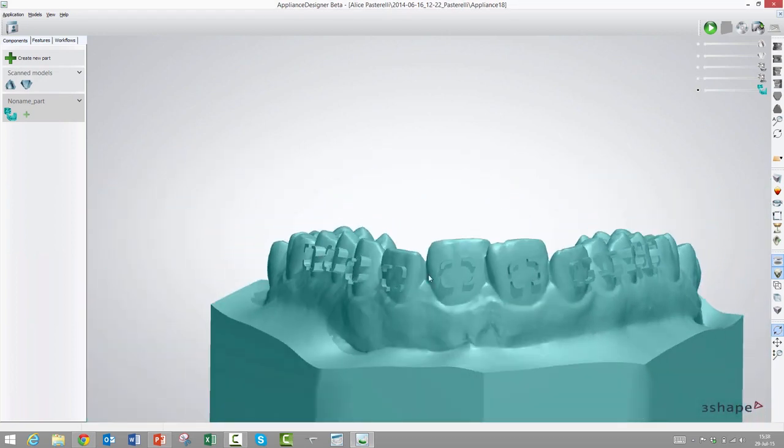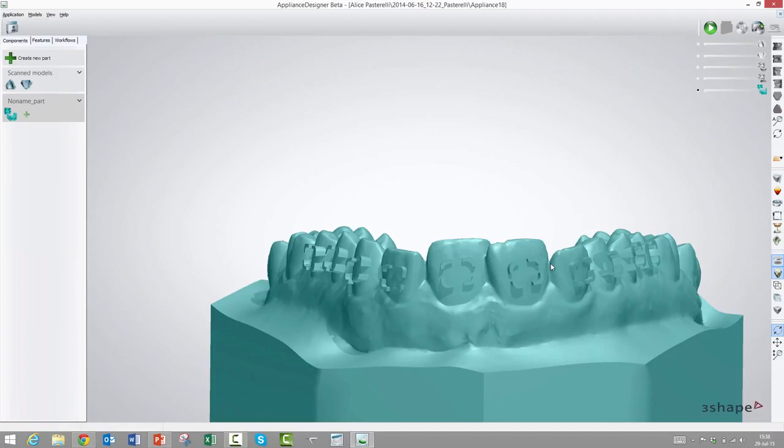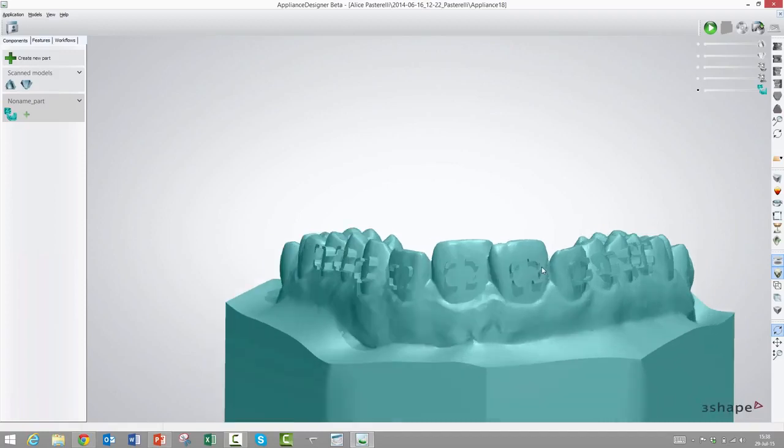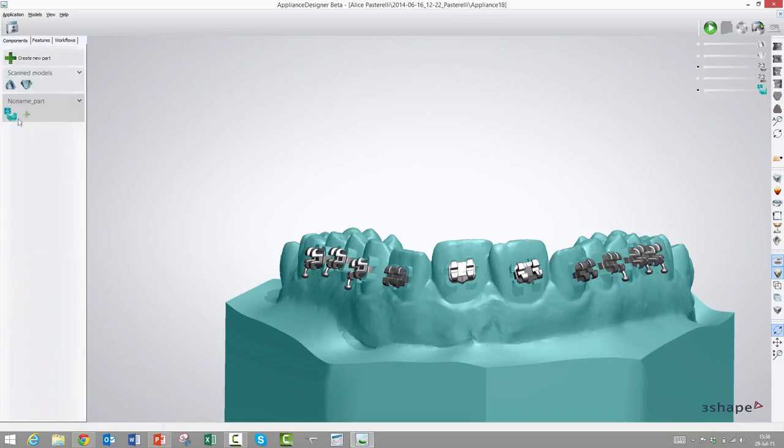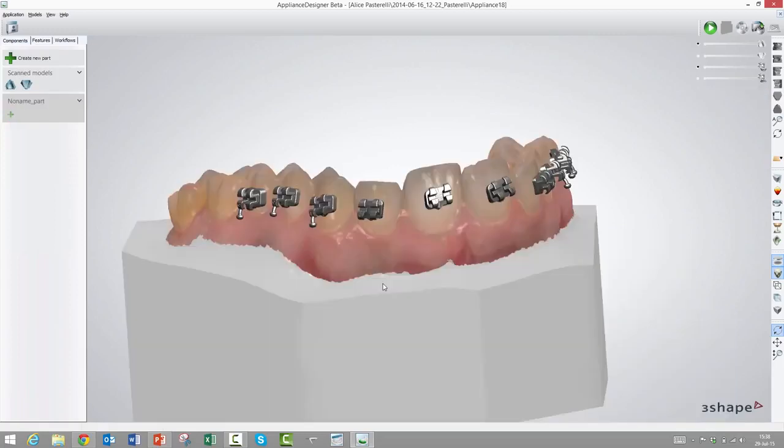You can set them parametrically down here, but other than that, as you can see, that one is ready to export. Then we could print this, put the brackets in, protect the wings and hooks by silicone, and then vacuum compress or thermoform on top of that. So that's the basic one.